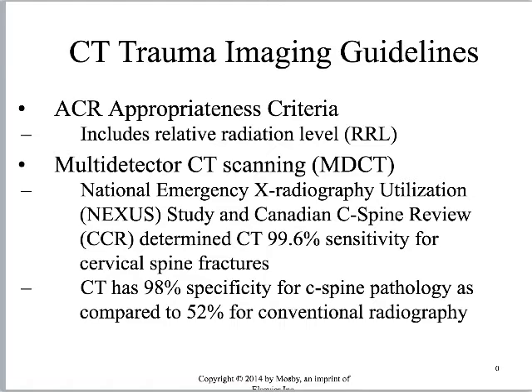And then X-ray has the advantage that, as we're looking at these images, we don't have to do any kind of reconstruction to see a true sagittal. With CT, sometimes a fracture can get lost in those sagittal cuts. So there still is definitely a place for things like a cross-table lateral C-spine in trauma protocols.